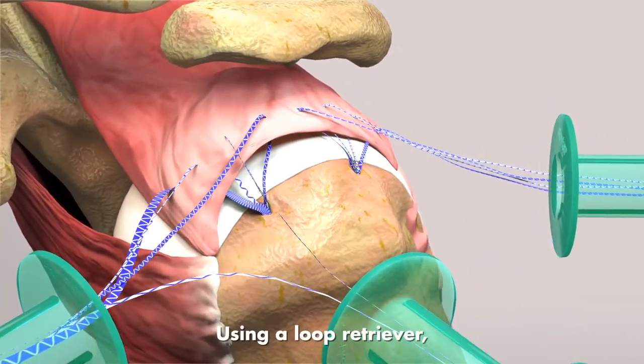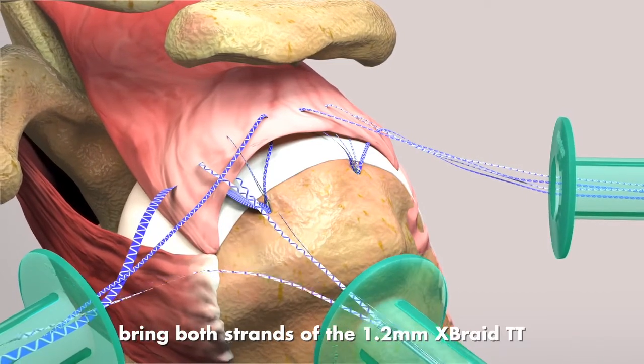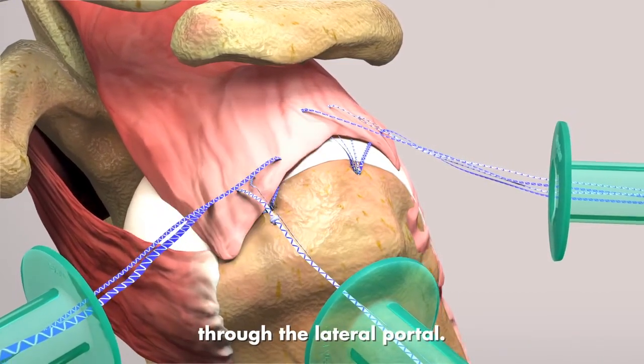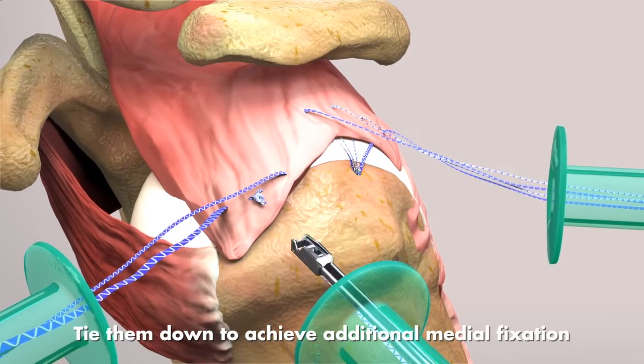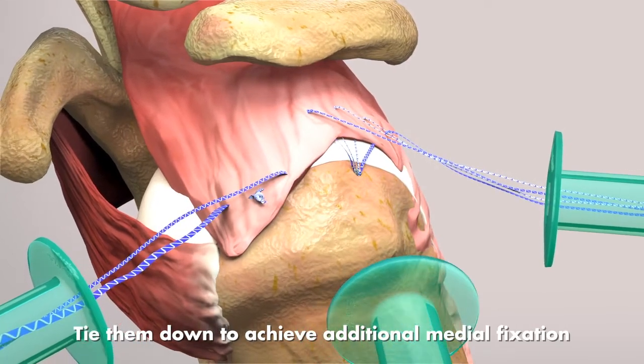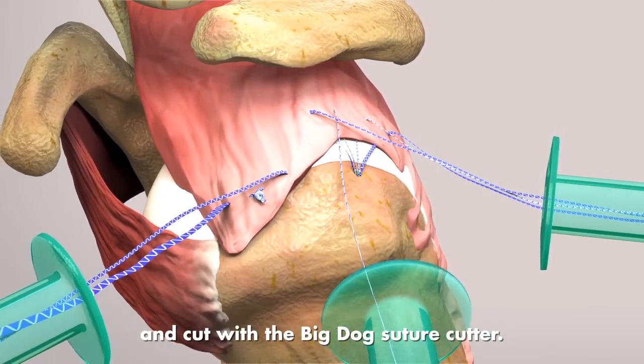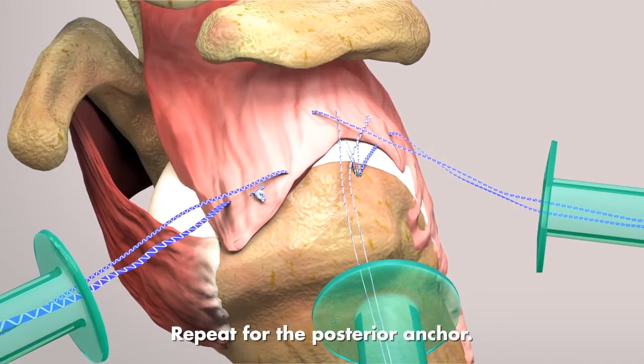Using a loop retriever, bring both strands of the 1.2mm X-Braid TT through the lateral portal. Tie them down to achieve additional medial fixation and cut with the big dog suture cutter. Repeat for the posterior anchor.